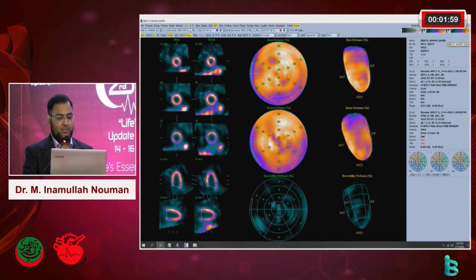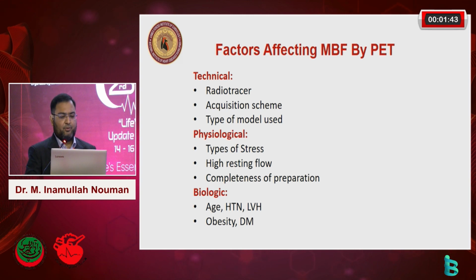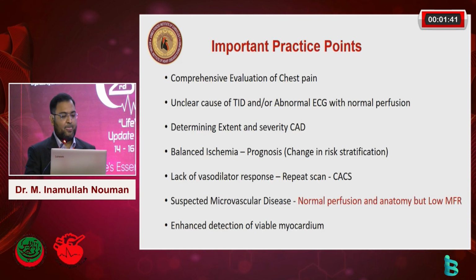And another case, this was a normal case, but here we did not see any rise in the stress myocardial blood flow. So this was an inadequate response to the vasodilator. These are a few of the factors affecting the MBF.